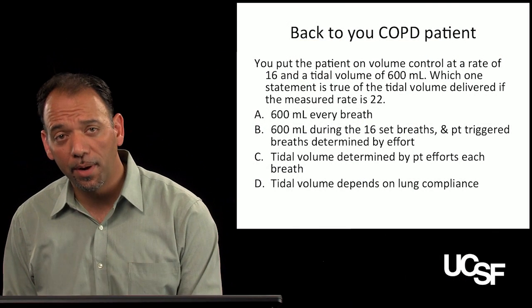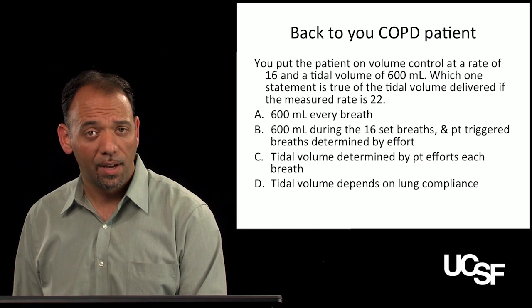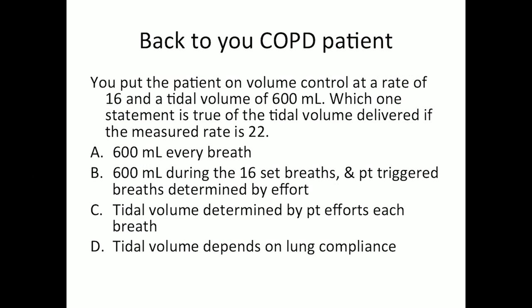So let's go back to the COPD patient. You put the patient on volume control at a rate of 16 and a tidal volume of 600. Which one statement is true of the tidal volume delivered if the measured rate is 22?